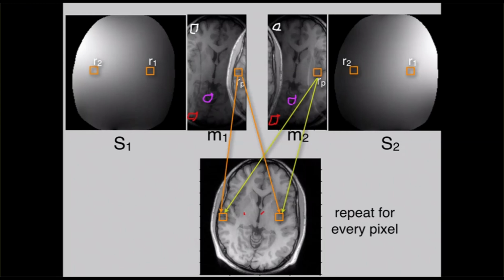And the reason that it's so separable is because when you undersample K-space in a uniform way, then you've got this really pure aliasing that happens. That is actually not true if you have a variable density undersampling or if you have radial. Then every pixel is overlapping with every pixel. And now you cannot solve for each one separately. You'll have to solve a really large problem.